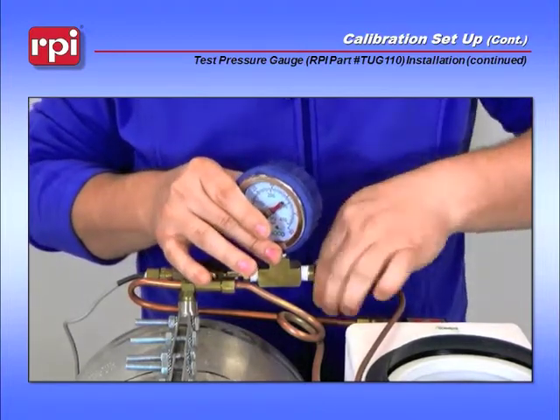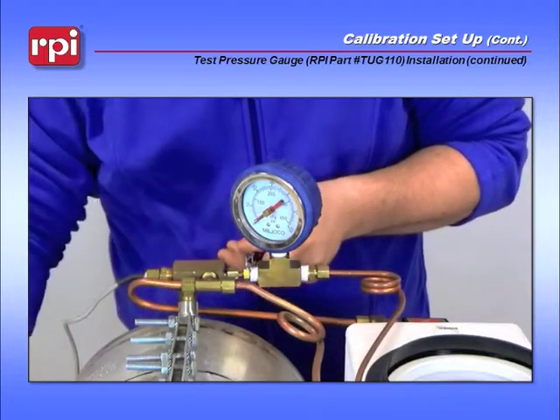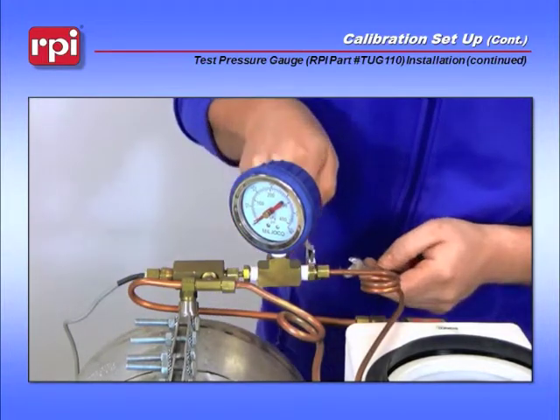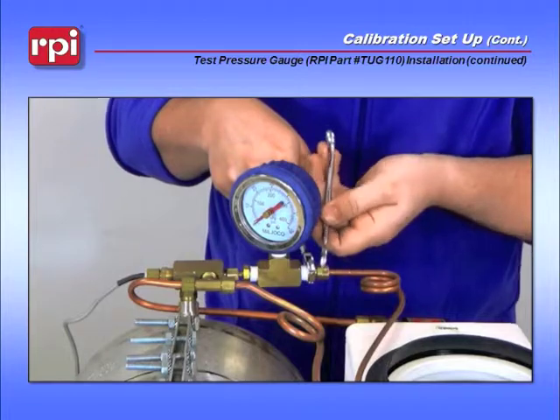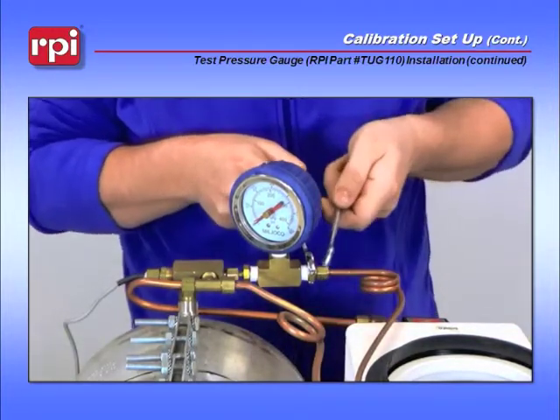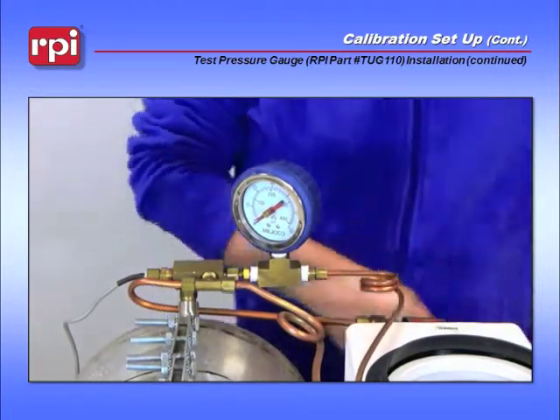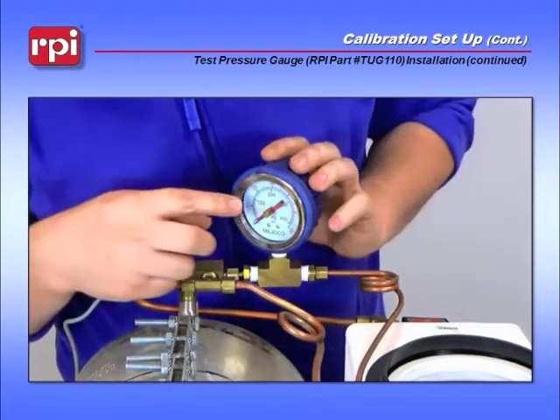For the last part, you want to grab a 9/16 wrench for the test pressure gauge side, and a 7/16 wrench for the small fitting, and tighten down both sides. Once both sides are tight, just ensure that your test pressure gauge red needle is placed at zero.